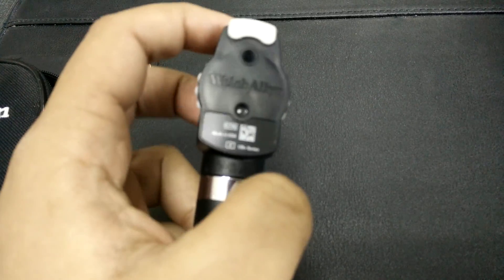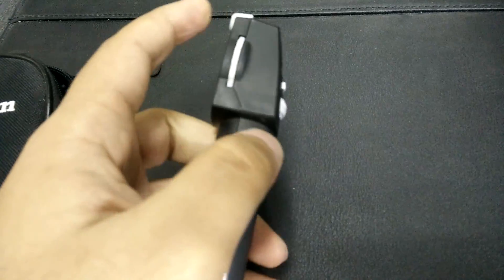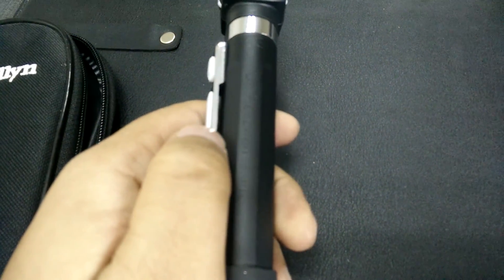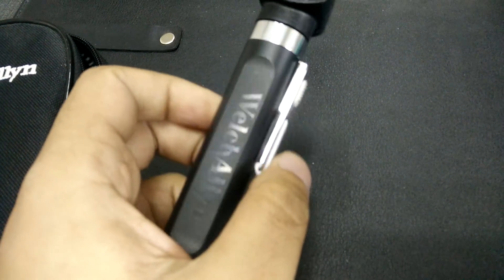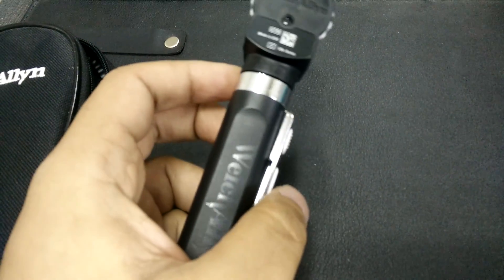I have used this on a number of patients and it is very good for the price. I would suggest that you visit the website and see it for yourself. There are a few online videos available but since I couldn't find one that was accurate, I made this one. I hope it helps everyone who is about to buy an ophthalmoscope. It cost me around 118 pounds and I have been using it continuously for the last three months, and I am very pleased with the results.